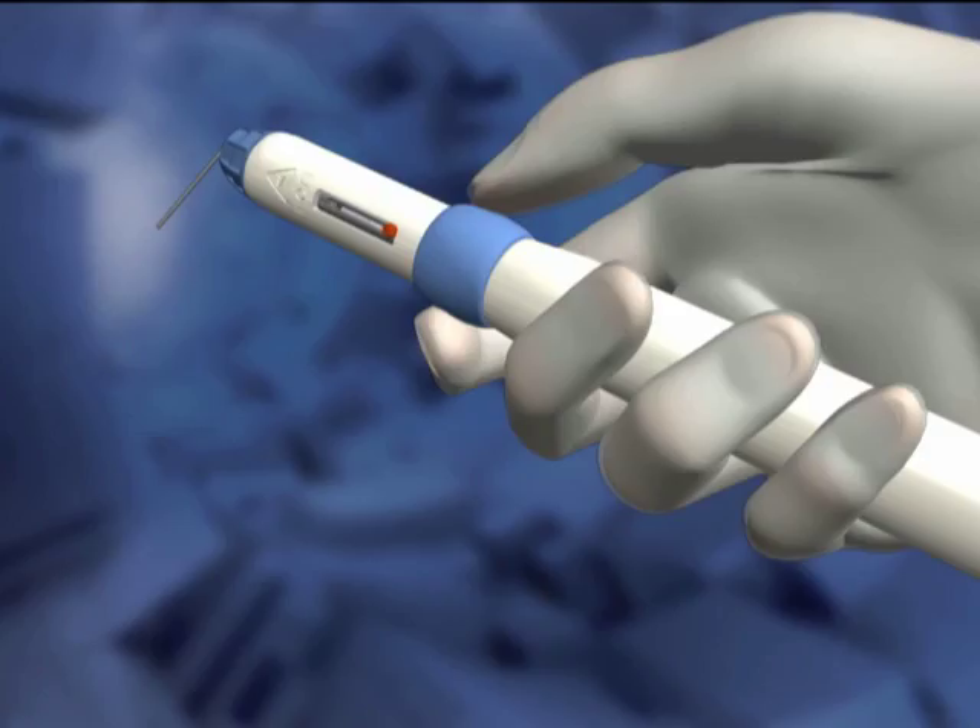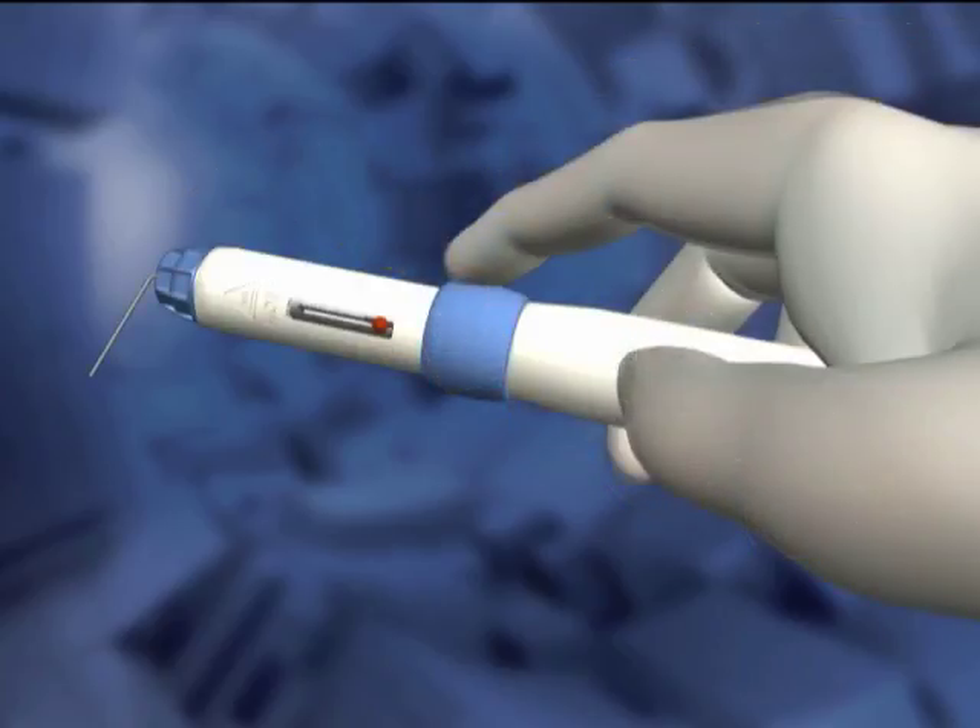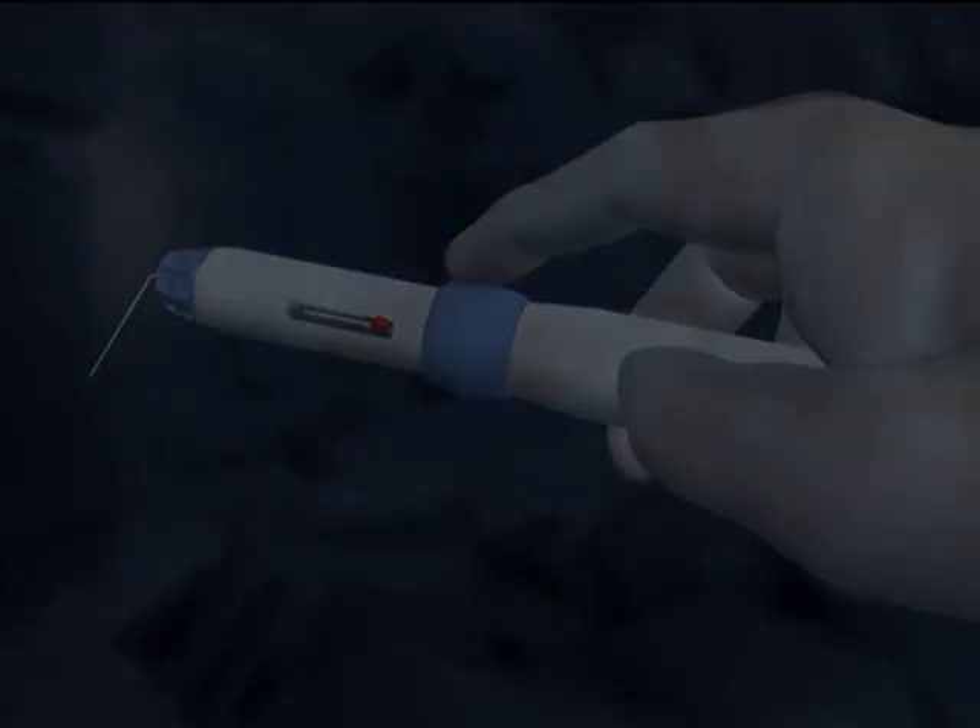The unit is easily held in an overhand grip. The thumb and forefinger can counterbalance each other, or the forefinger can be the only finger extended to the activation cuff. The thumb, middle, ring, and pinky fingers then wrap around the handpiece. The palm of the hand provides the counterbalance when pressure is applied to the activation cuff.